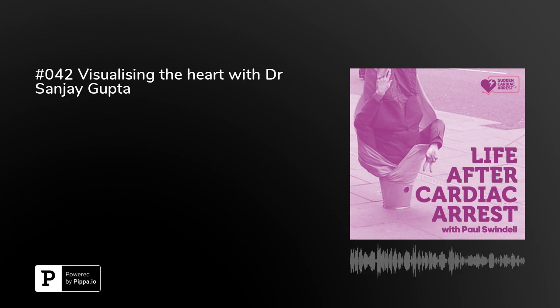And so what would you progress to next if the echocardiogram hasn't told you what you needed to know, or it's shown that there's a problem there, but you need a little bit more detail? Where would you go next? So the echocardiogram is like, if you thought of the heart as a car, the echocardiography is looking at the engine of the car. It doesn't tell you what the arteries that supply the blood to the heart look like. So with an echocardiogram, you can't see the heart arteries. You can't tell whether the heart arteries are narrowed or anything. All you can tell is that there's been no damage to the heart.